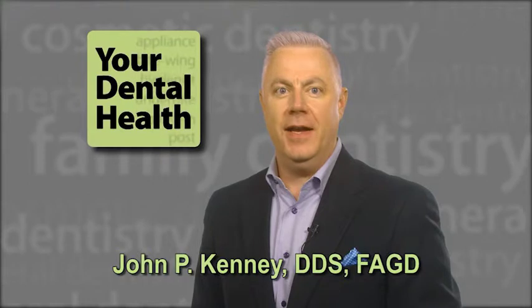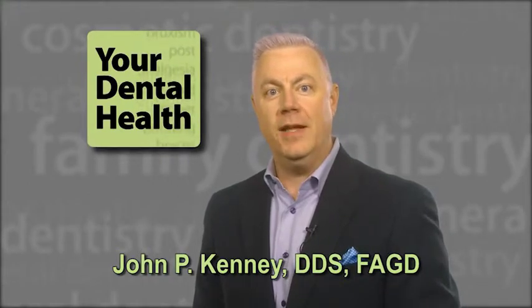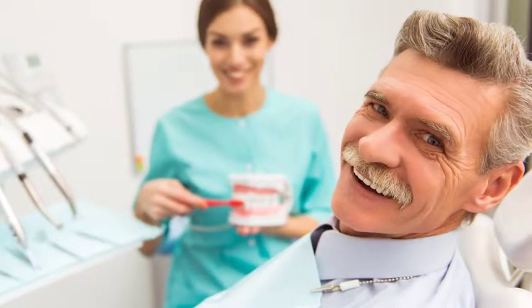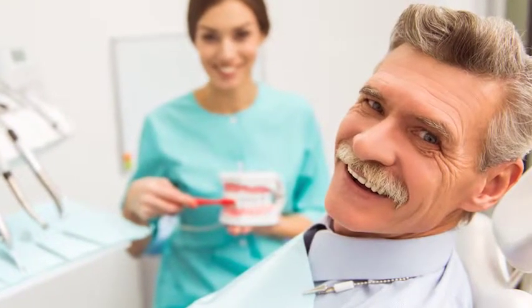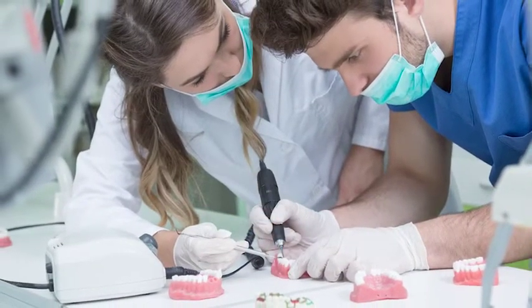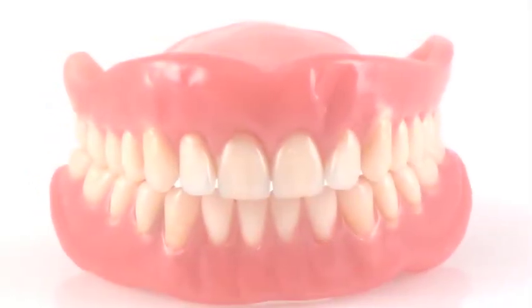A denture is a device that is inserted into the mouth to replace natural teeth and provides support and structure to the cheeks and lips. There are a variety of different types and forms of dentures that a dentist may recommend to the patient. A removable denture is what most people imagine when they think of dentures. These dentures rest on an acrylic or plastic base and fit securely but comfortably on the gums. These dentures can be removed easily by the wearer.